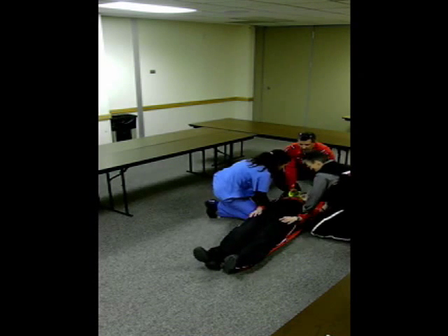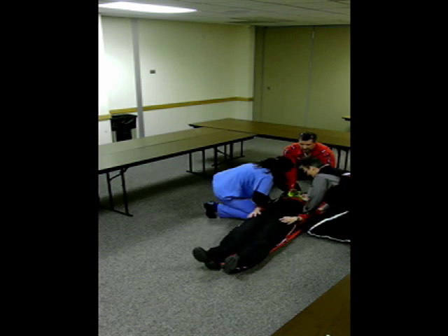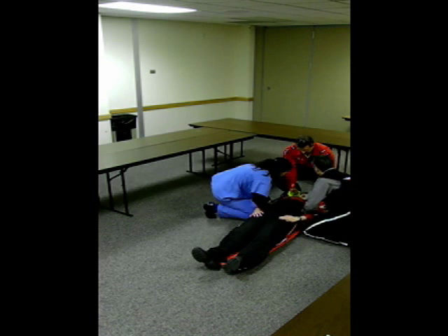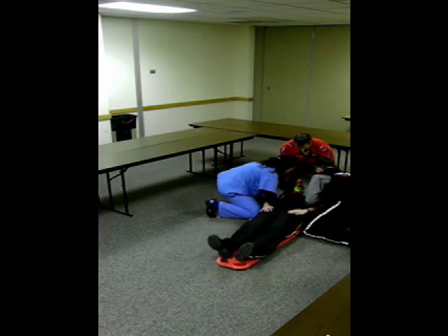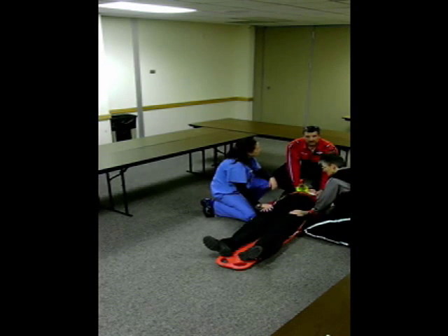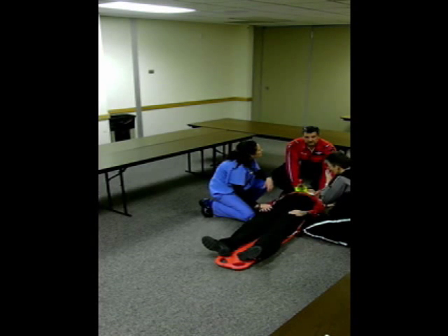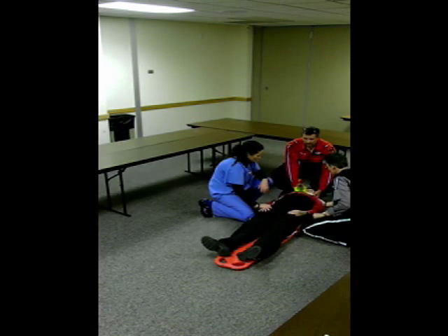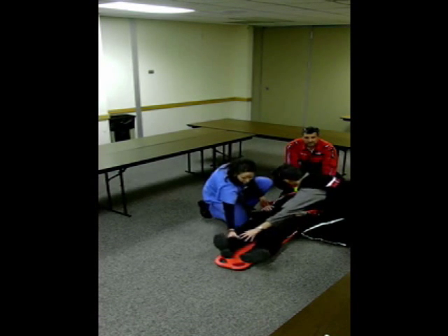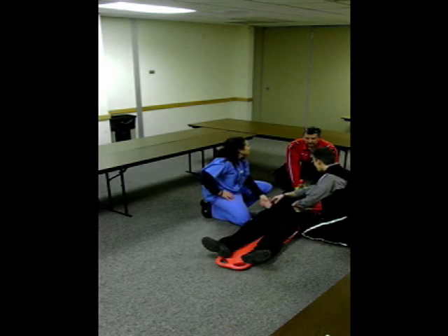Now we're going to reposition the patient so that they're fully on the board. When everybody's ready, on the three count we'll move the patient. One, two, three. From this point we will go ahead and apply head blocks that you would have in your departments and strap the patient down on the board. We check their distal pulse movement and sensation again. And if we had the time, we could pad any voids to make them more comfortable on the backboard.